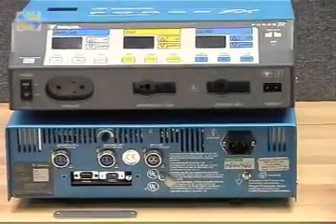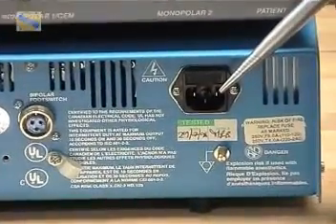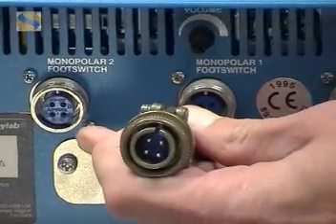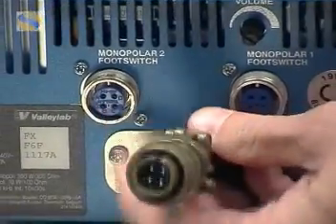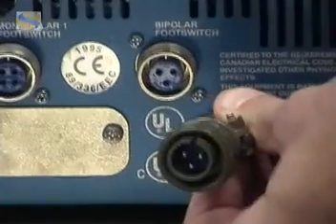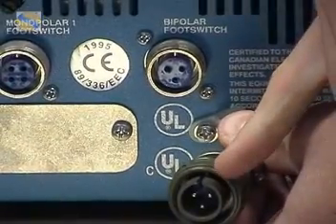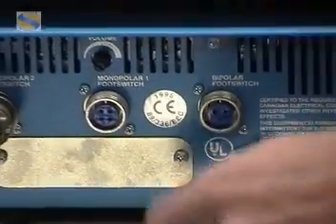On the back panel of the Force FX are the mains input, which is a standard IEC mains connector, the 4-pin monopolar connectors, monopolar foot switch 1 and monopolar foot switch 2, which mate with the 4-pin monopolar foot switch plugs, and the 3-pin bipolar connector, which mates with the bipolar foot switch plug. The alignment notch on these plugs should be orientated correctly, the plug inserted, and the collar finger tightened.